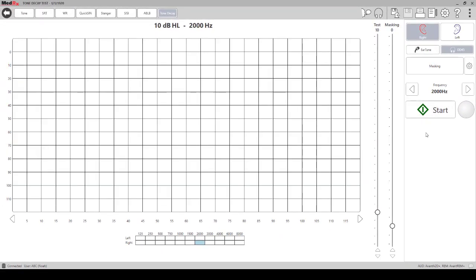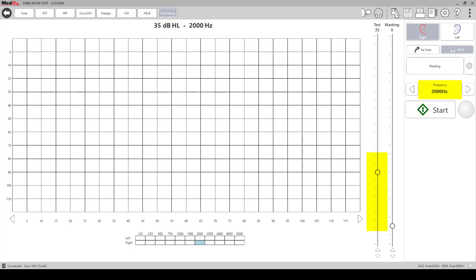To instruct the patient, you want to make sure that they either raise their hand or press their response button for the entire time that they hear the tone. In this example, we want to start at 2000 Hertz, and we would like to start presentation at 35 decibels on the left side.